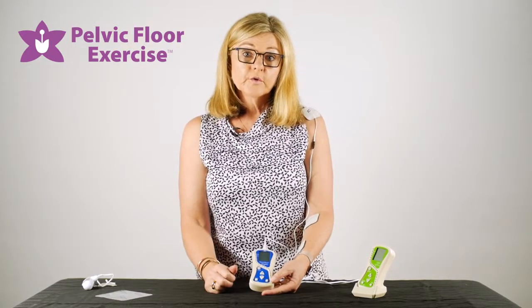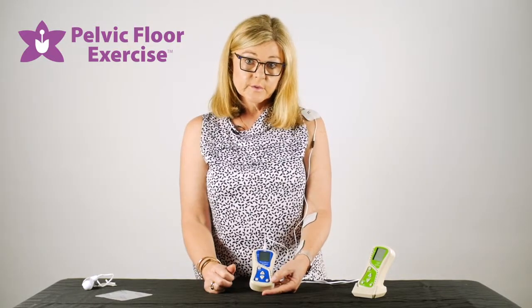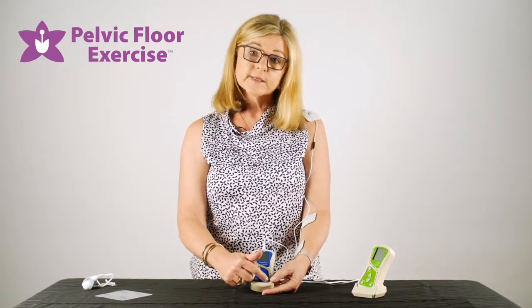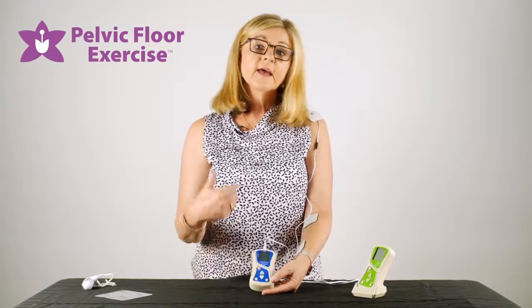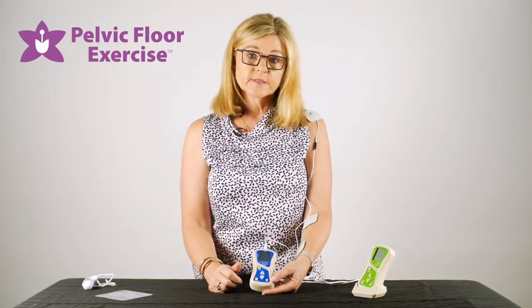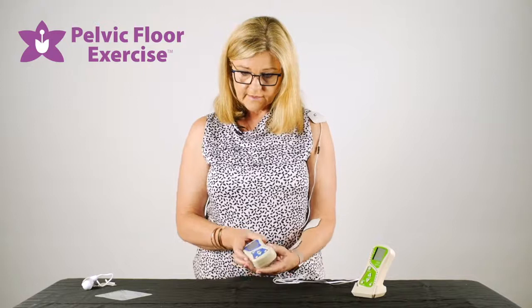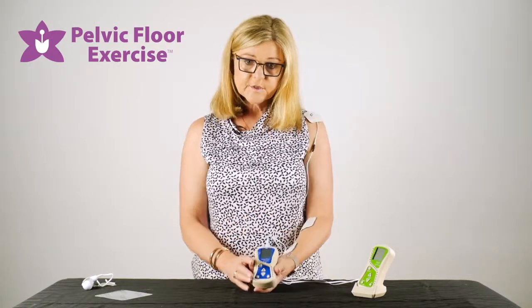Once you've selected the wide setting, press the ESCAPE button and your parameters for your program are now set. You can start your treatment session with your patient, and at any time you can hold the SET button down and change any of those parameters if you feel you need to progress your patient.